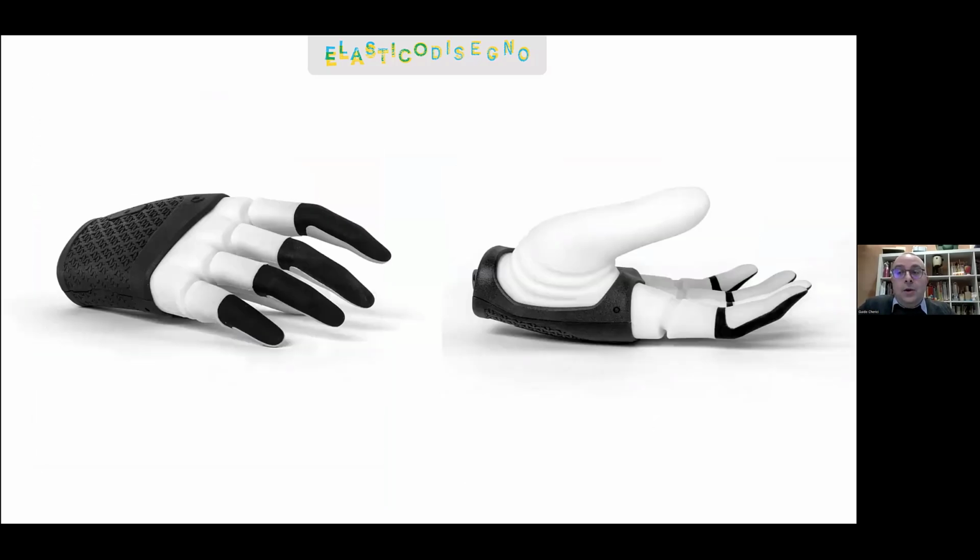And so the hand was launched on the market, introducing many innovations compared with the competitors. But still, it was black and white. We used white for the silicone parts, which are the glove and the co-moldings on the fingers, and black for the plastic parts, because those came straight from the 3D printer. But for the project to be really successful, we still needed color.